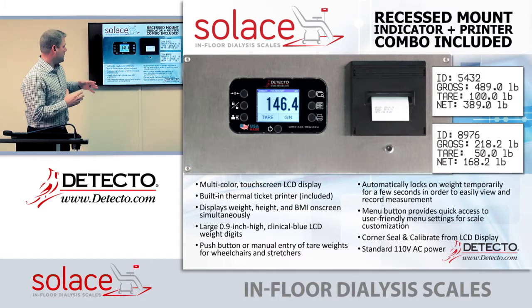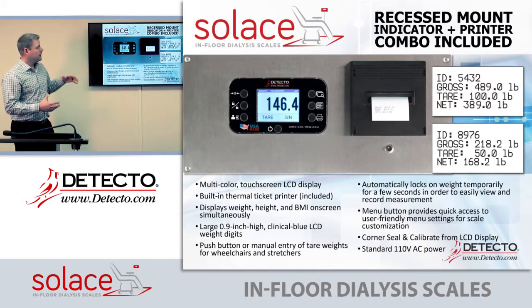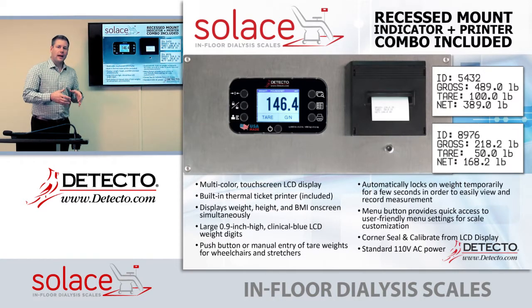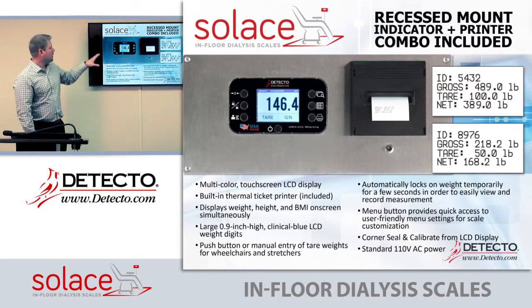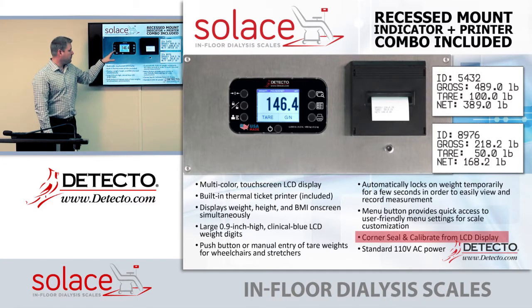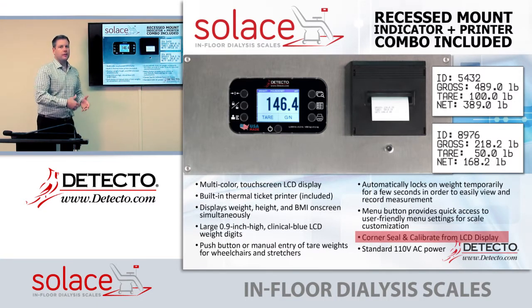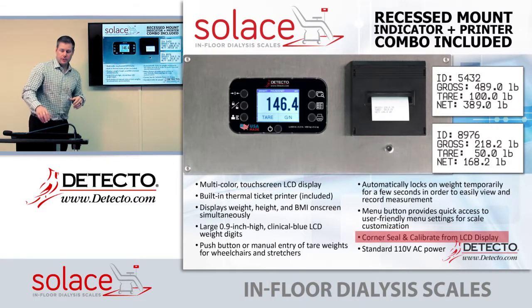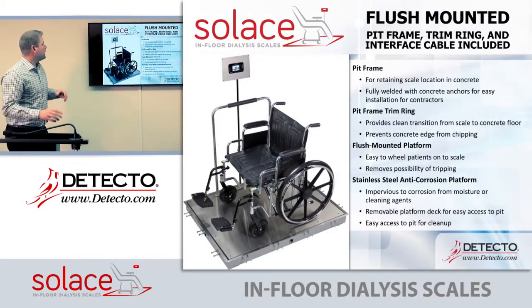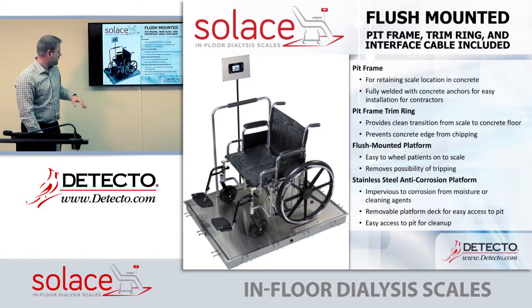A big feature for dialysis clinics is the calibration and servicing capability. The scale has four analog-to-digital converters — one for each load cell — so you can corner trim and calibrate the scale directly from the instrument. There's no need to pull the scale out or remove the cover to maintain or calibrate it; everything can be done from the instrument.